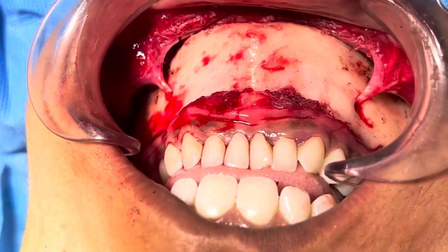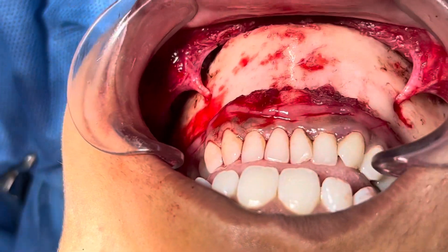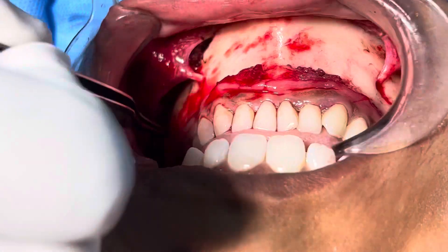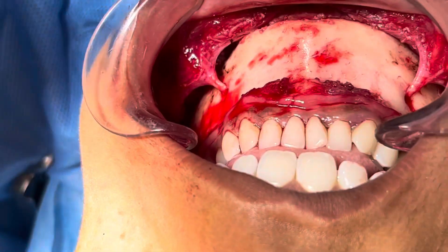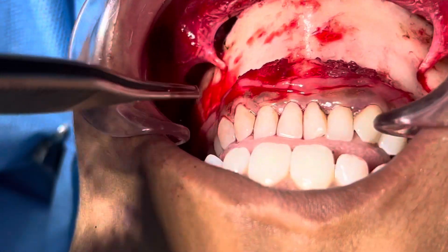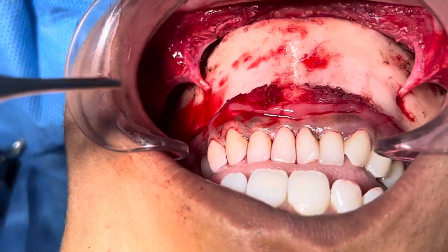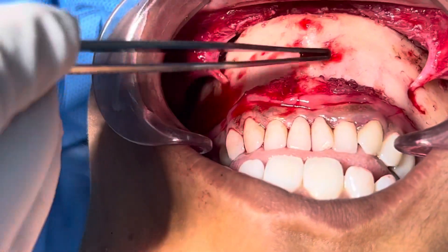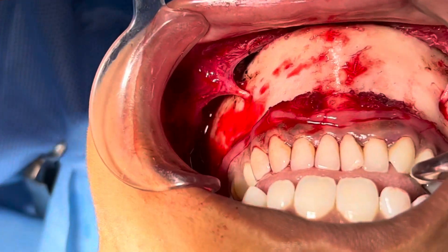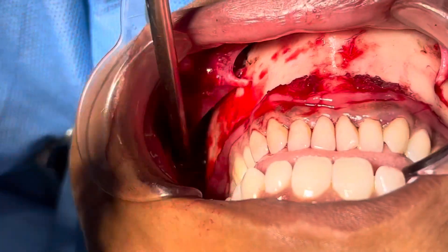We've exposed the chin here. We're doing genioplasty, and also V-line surgery for this patient. We're doing some work on the angle and facial slimming as well. The patient's lower jaw is very broad and she desires a much more pointy, more proportional chin, along with work on the ramus, body, and angle — that's why we've done this section all the way up to the ramus.